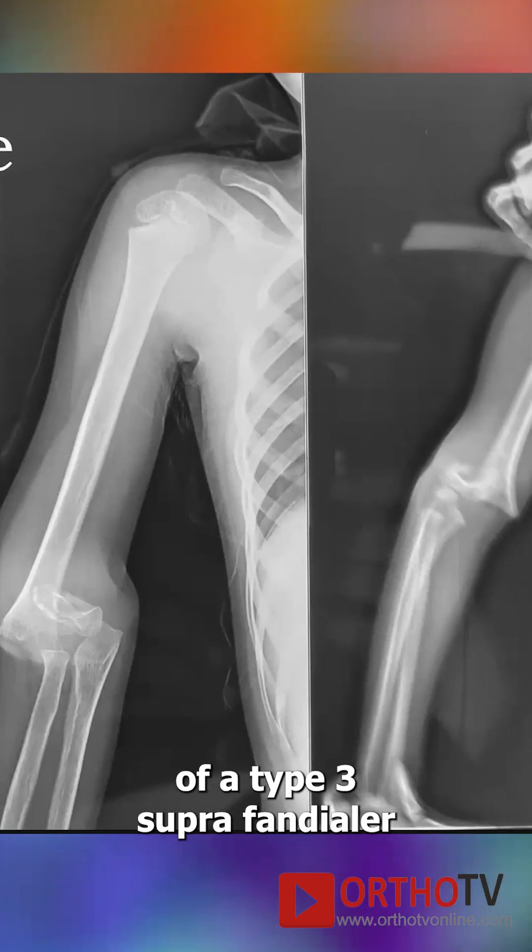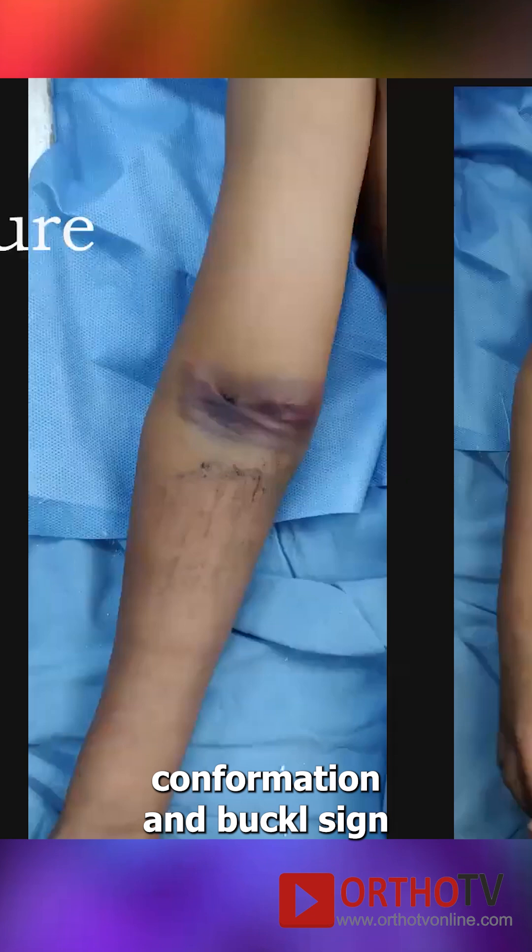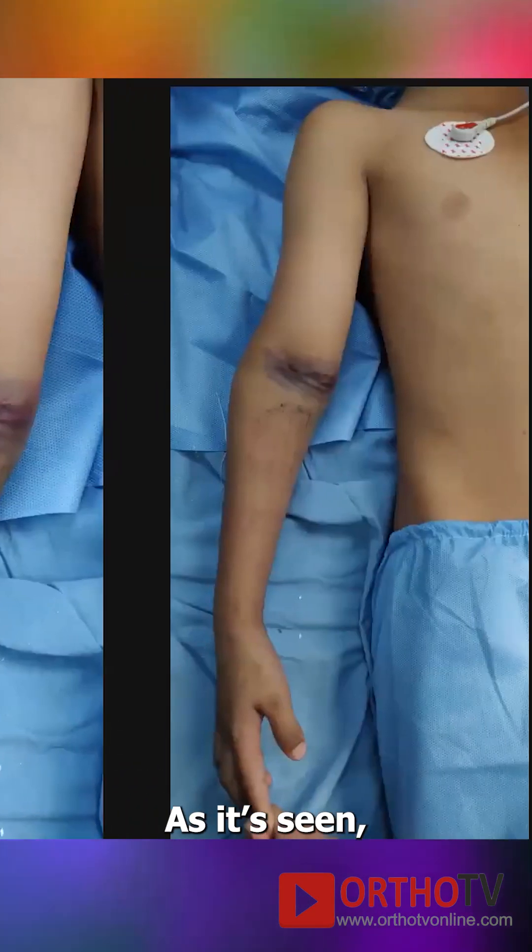This is a pre-operative radiograph of a type 3 supracondylar fracture with a brachialis perforation and a pucker sign. That's the ecchymosis as it is seen.